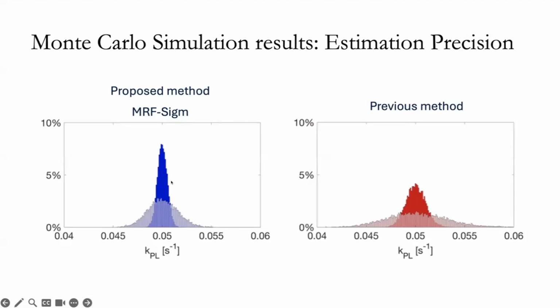And if we look at the actual distribution of these results, even though this is a dictionary-based approach where we have a discretized kind of multiple choice result of parameter estimation, they still look very normally distributed at different noise levels. So here in the gray is a higher simulated level of noise, and in the dark blue is the lower simulated noise.